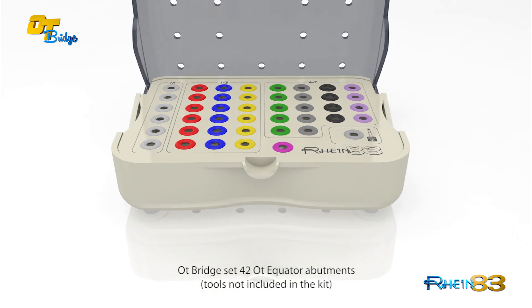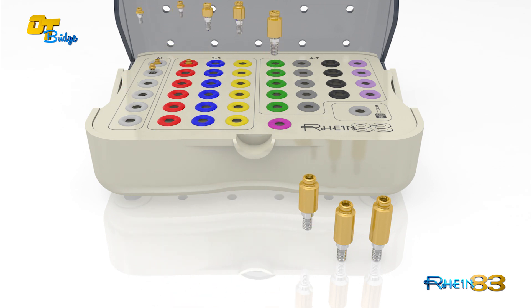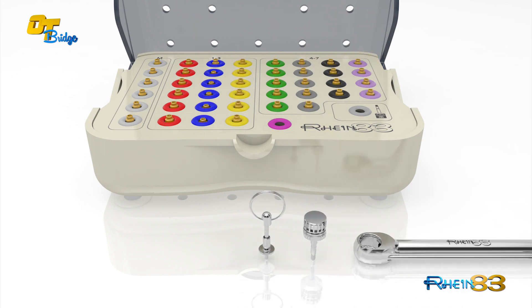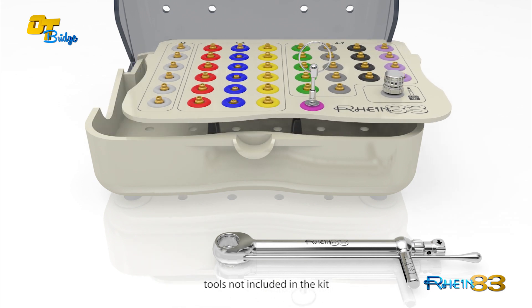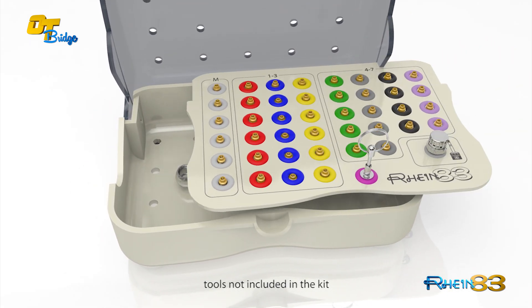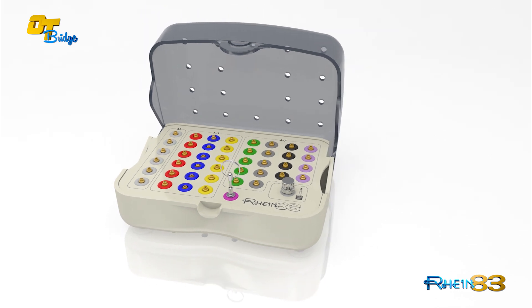The OT Bridge Clinical Set includes 42 OT Equator abutments. The dentist can select 42 OT Equator abutments of choice, customized to meet the needs of the clinic in terms of diameters, cuff heights, and connections accordingly to the implant system used. The advantage is to be prepared and operational during immediate loading or during daily chair side procedures.